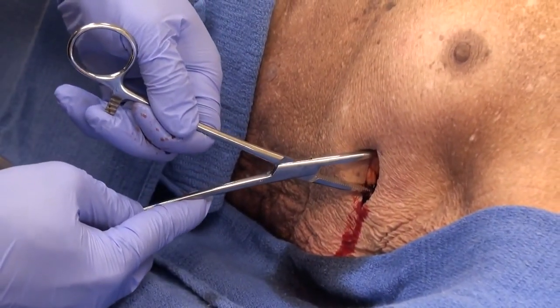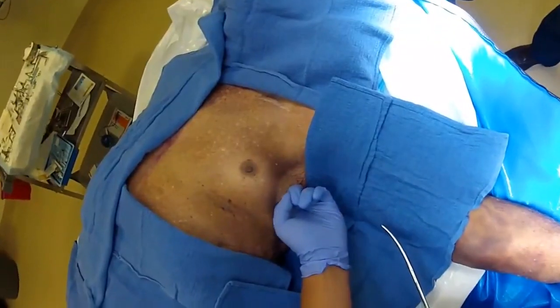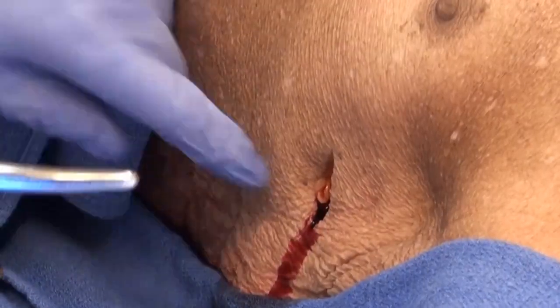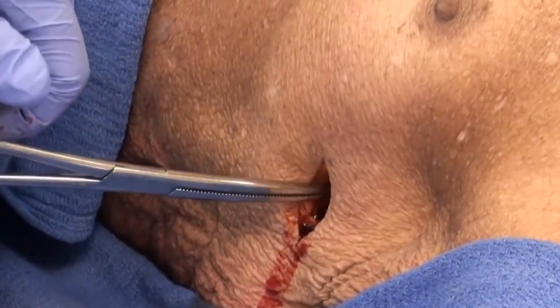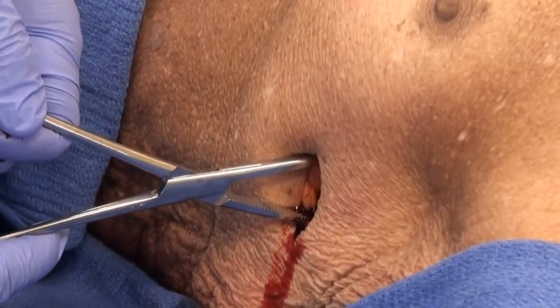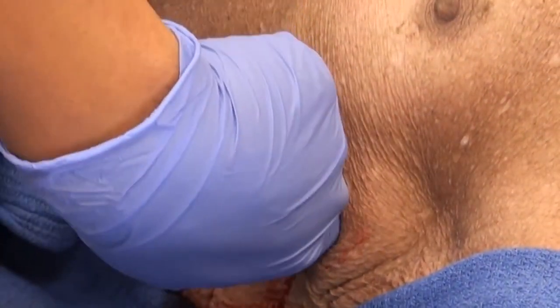place. Upon entry into the pleural cavity, digital exploration of the wound and pleural space should be undertaken. This will allow for the evaluation of adhesions between the lung and the chest wall, and may also help to avoid insertion of the tube into the lung parenchyma or abdomen.